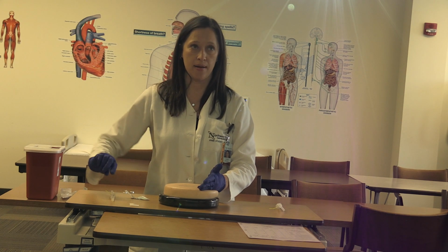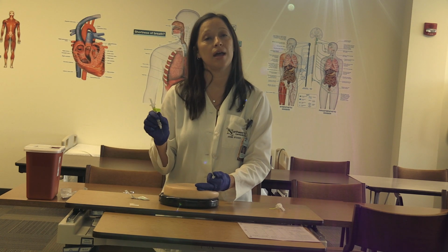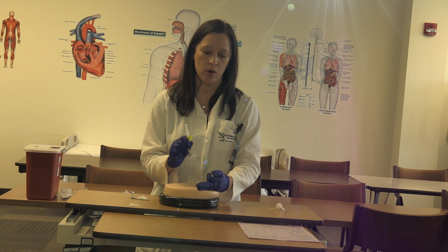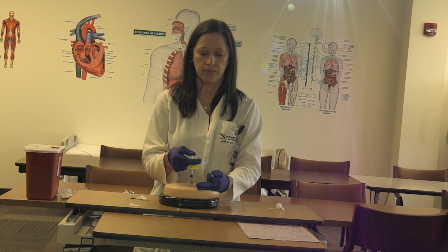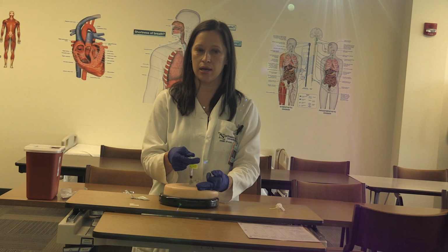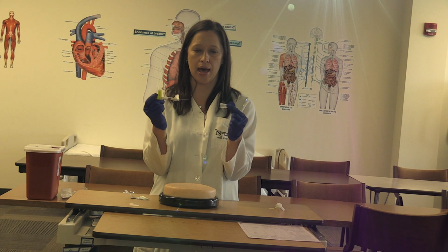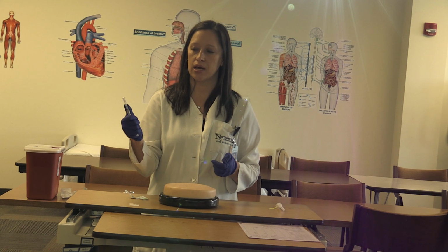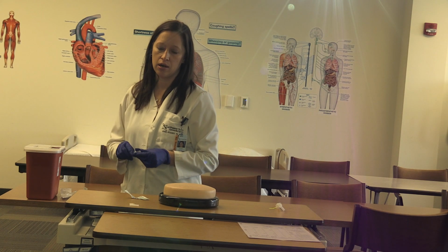And you're going to wait for it to dry. And then you're just going to pick your needle up and we're going to go in at a 90-degree angle. So you're going to tell your patient, okay, there's going to be a big poke. 1, 2, 3. Go in at a 90-degree angle, administer the medication. Wait 10 seconds, and then you're going to withdraw the needle and your hand at the same time. And then you never recap like this. You always either, if it has a syringe protector on it, you do this, or if it doesn't, you just pivot over to the sharps container and throw it away.